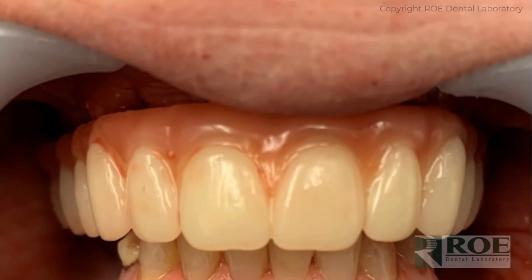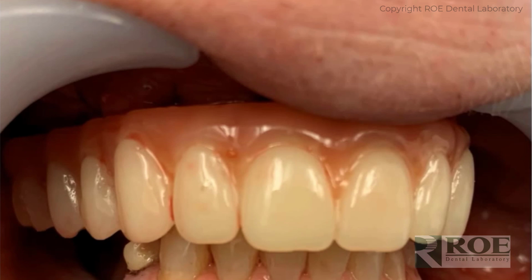Some nice photographs are taken. So this was a very nice case. Fortunately, in this case there isn't a lot of posterior occlusion for equilibration. I know the seating part was very, very quick and a very nice result.